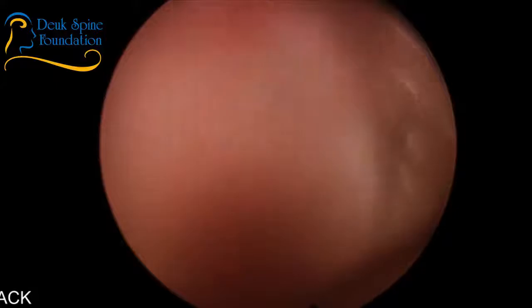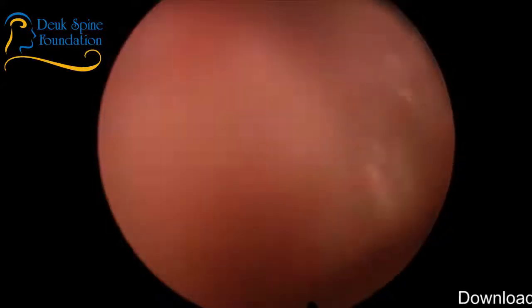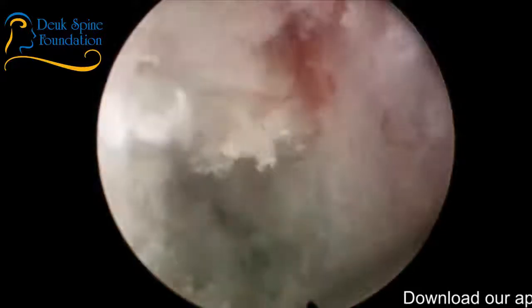All right, what else can I do here? Let's see if we can get the Grabzilla back in for one or two more bites. Stand by. See if we can bring home any more of this herniation.